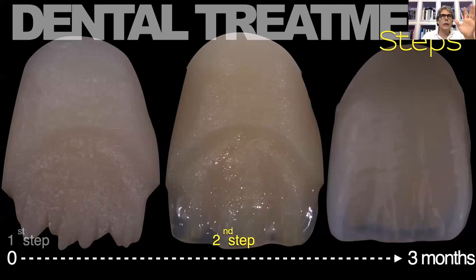I use the cutback technique, like in this case, only in the cases in which I have to disguise dyschromic colors of the teeth after their preparation. In this case, I have to use low translucent materials, which are obviously not translucent. But in order to give a more natural appearance to the incisal edge of these upper frontal teeth, when I use this kind of material, I always apply my cutback technique.